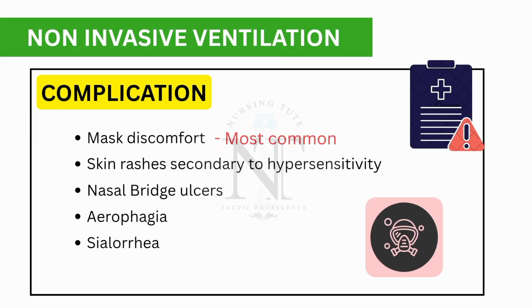At last, complications of NIV. The most common complication is mask discomfort and skin rashes that are secondary to hypersensitivity or infection. Rarely, nasal bridge ulcers may also happen and aerophagia may arise. And sometimes the most serious effects such as pneumothorax, pneumocephalus or pneumomediastinum may also occur, okay?